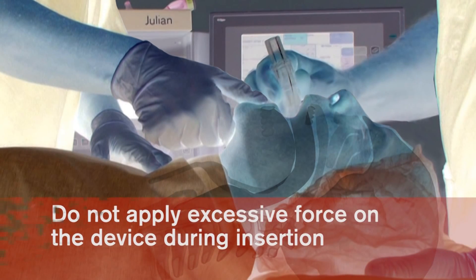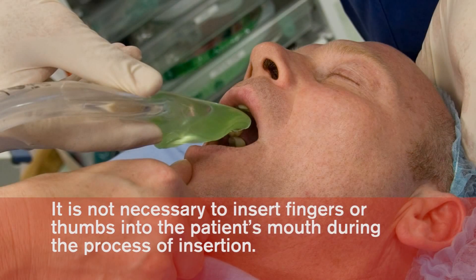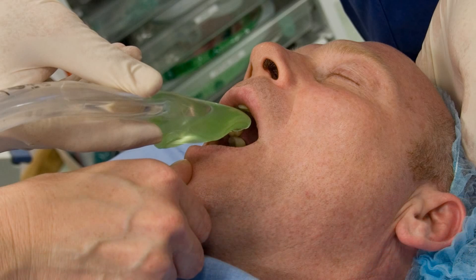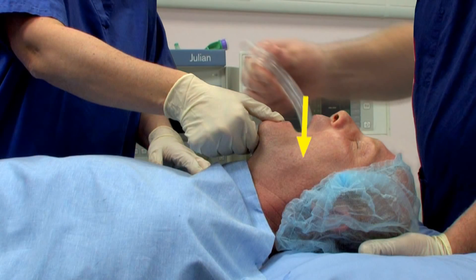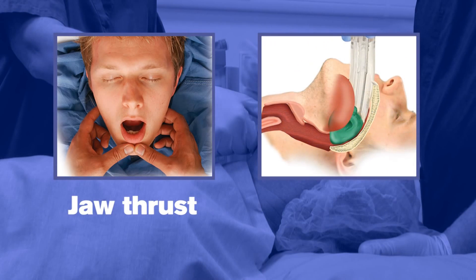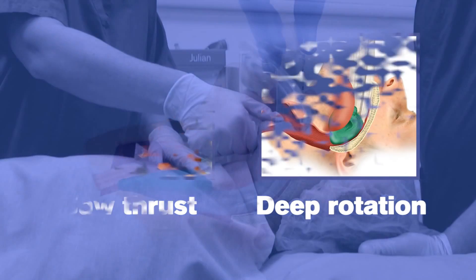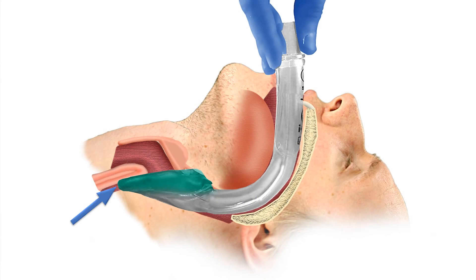Do not apply excessive force on the device during insertion. It is not necessary to insert fingers or thumbs into the patient's mouth during the process of insertion. If there is early resistance during insertion, a jaw thrust or insertion with deep rotation is recommended. When inserted to a definitive resistance, the tip of the iGel should be located into the upper esophageal opening and the cuff should be located against the laryngeal framework.